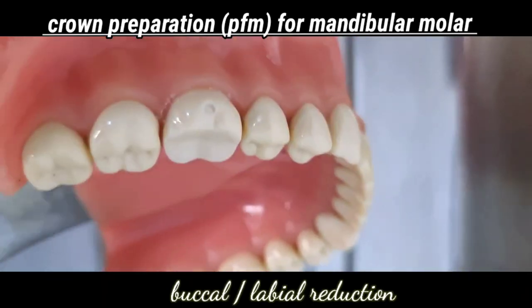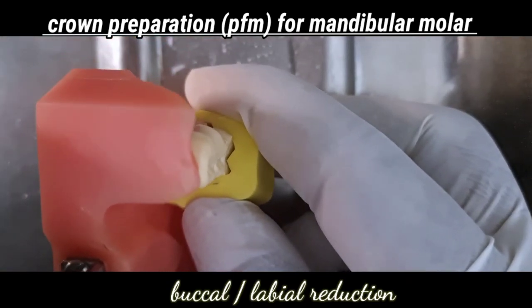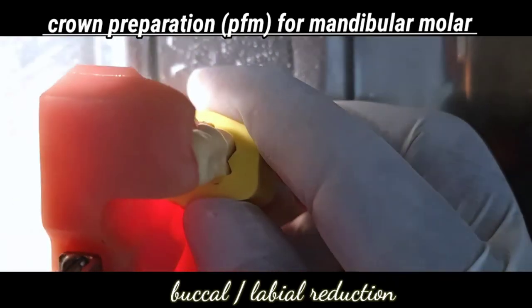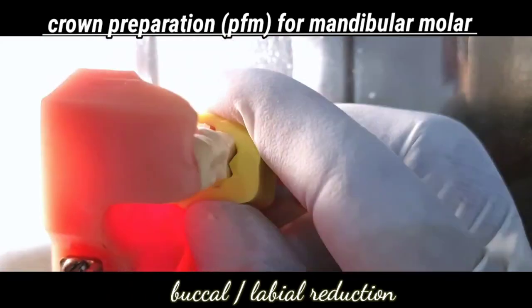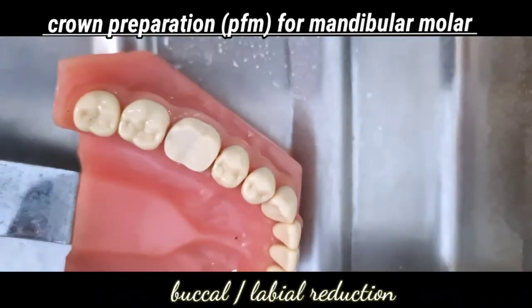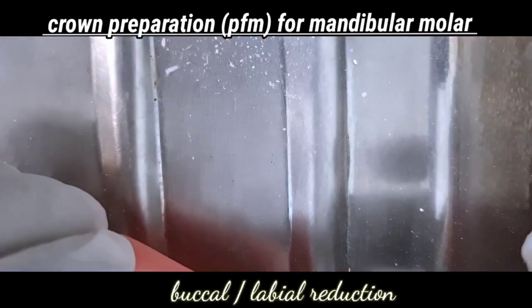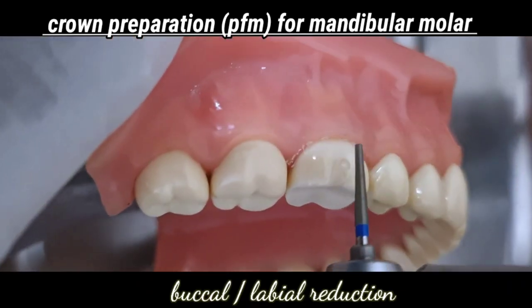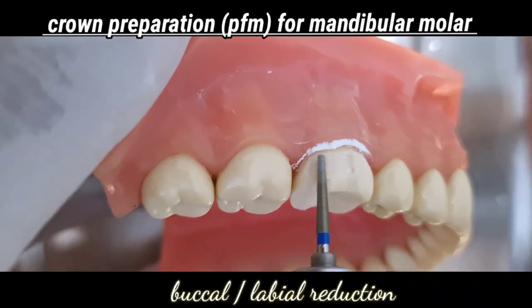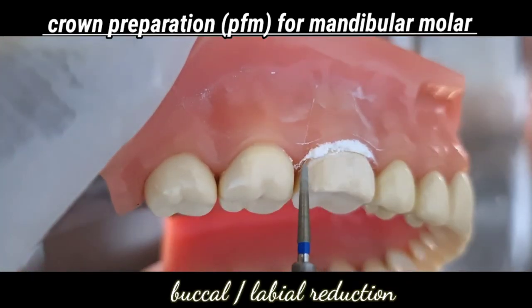The thumb rule for labial reduction is biplanar reduction, which means labial reduction is done in two planes, the gingival plane and the occlusal plane, which is the incisal plane for the anterior teeth. 1.5 millimeters of labial reduction is done for a PFM crown with a modified shoulder marginal line. Remember, biplanar reduction for the labial reduction, two planes are gingival plane and occlusal, following the anatomy of the teeth.